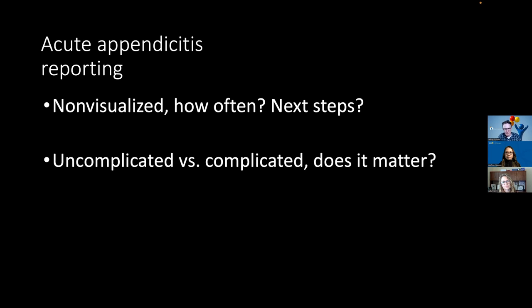At least here, I think that serial ultrasound is underutilized. I'm a big fan of that, repeating it 10 or 12 hours later. I feel like oftentimes here we just jump straight to either CT or MRI, whereas I do wish they would use serial ultrasound a little bit more often.